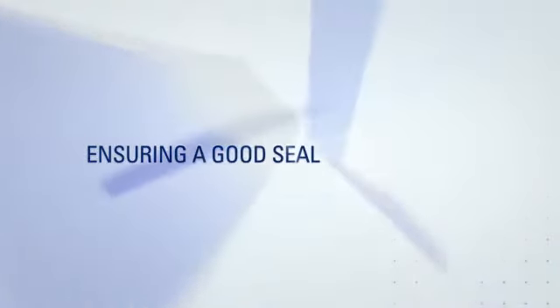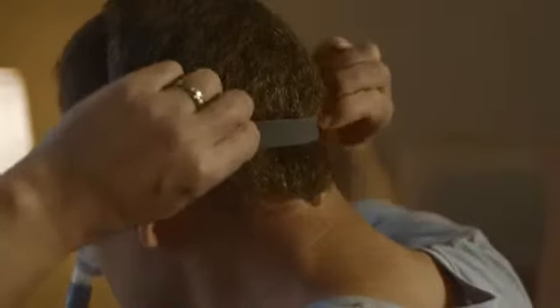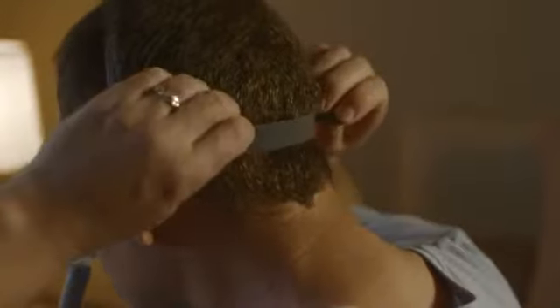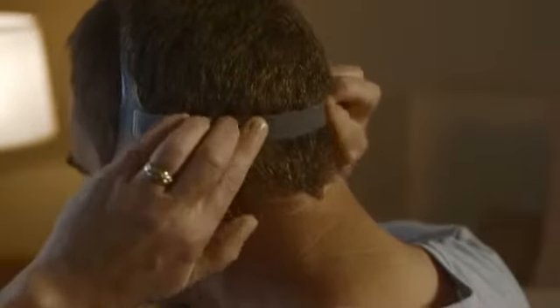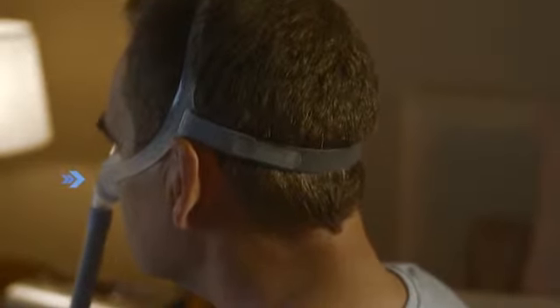If your mask leaks, readjust the back strap before tightening the top buckle, as the top headgear positions the mask at the right place on your head, while the back strap brings the mask closer to the face, so it directly affects the seal between the mask and your face. If there's still air leaking out and you're certain that you've adjusted the headgear and back strap well, then you may need to gently reposition the nasal cushion so it sits comfortably and securely.